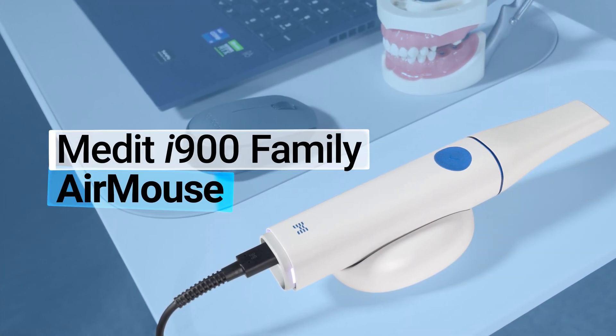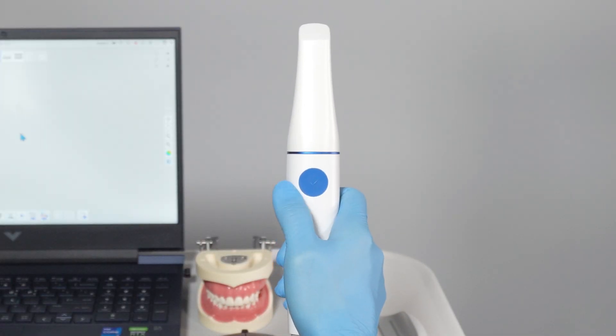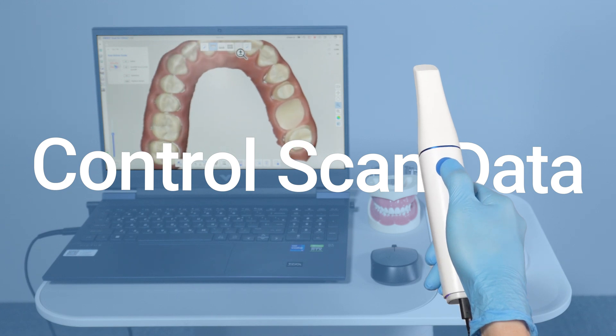Welcome! In this video, we explore the Air Mouse feature of the Medit i900 family. You can start and stop scanning and control scan data without a mouse. Here's how it works.